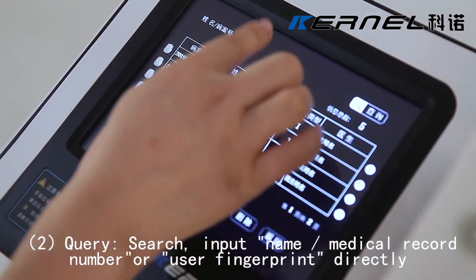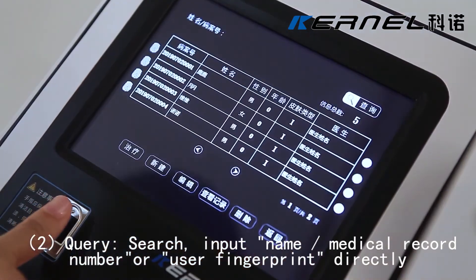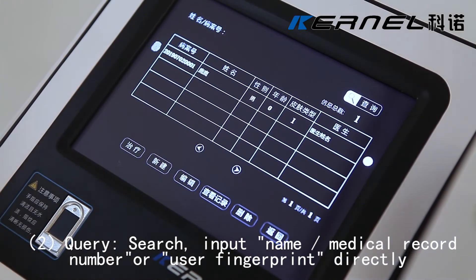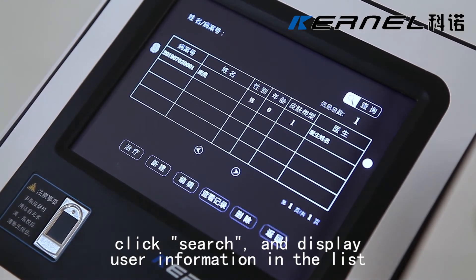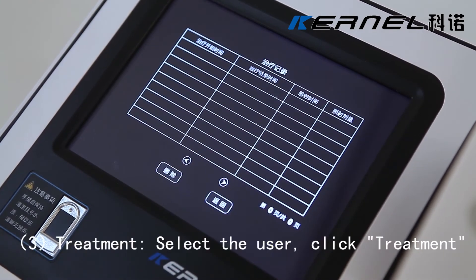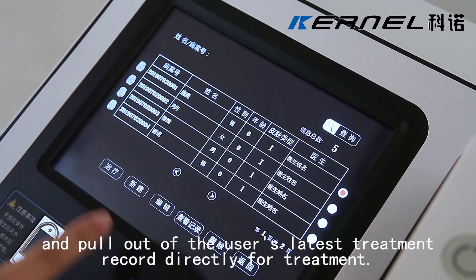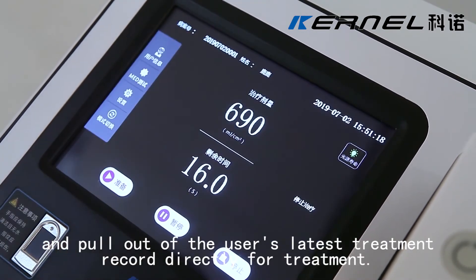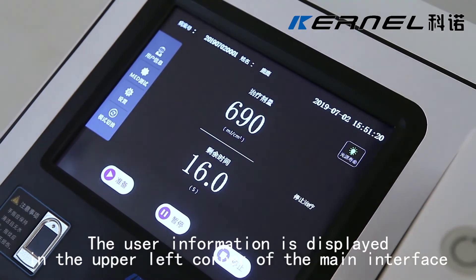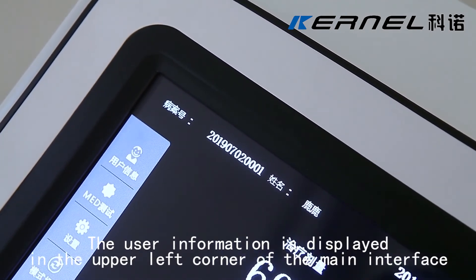To query, search by inputting name, medical record number, or user fingerprint. Directly click Search to display user information in the list. To start treatment, select the user, click Treatment, and pull up the user's latest treatment record directly for treatment. The user information is displayed in the upper left corner of the main interface.